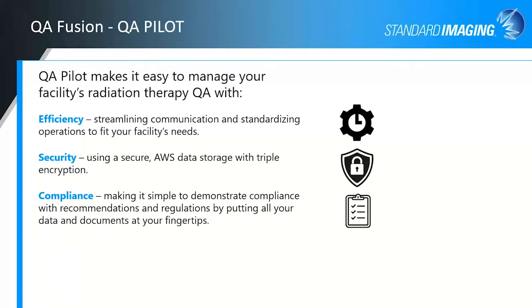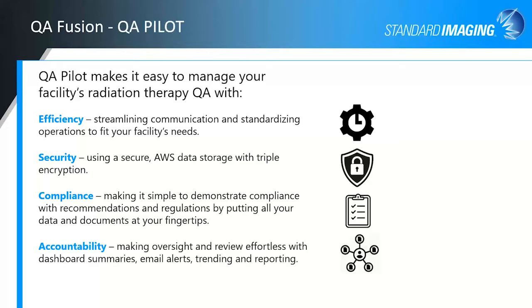We help you with your compliance. Again, make it simple to demonstrate that you are following regulations and recommendations by putting all of your data and documents at your fingertips, and give limited access to an auditor or regulator to view those documents. And we help you with the accountability, right? Making sure that the oversight and review is effortless. We do that with dashboard summaries, HIPAA compliant internal email alerts, providing a variety of trending and reporting.